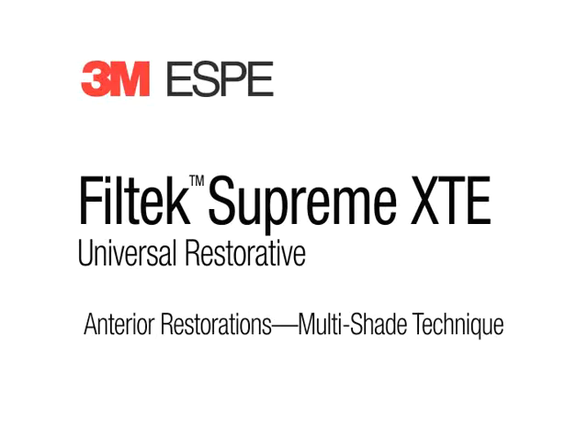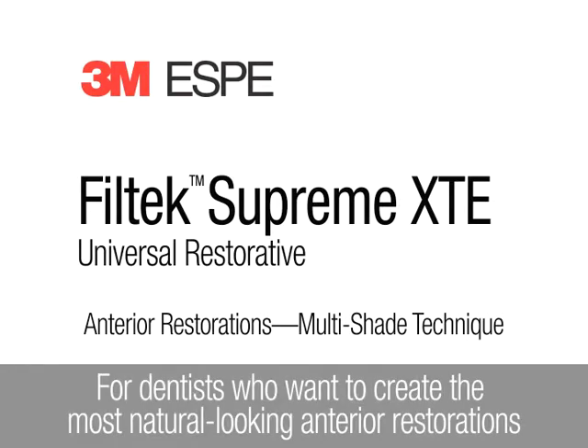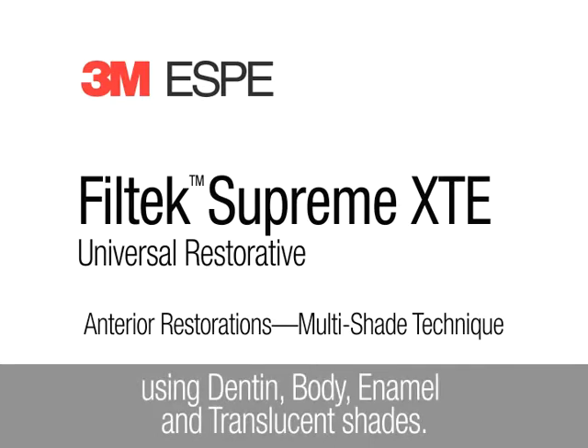Filtec Supreme XTE Universal Restorative. This animation demonstrates how to create anterior restorations using a multi-shade technique. For dentists who want to create the most natural looking anterior restorations that are virtually undetectable, 3M ESPE recommends a multi-shade layering technique using dentin, body, enamel, and translucent shades of Filtec Supreme XTE Universal Restorative.